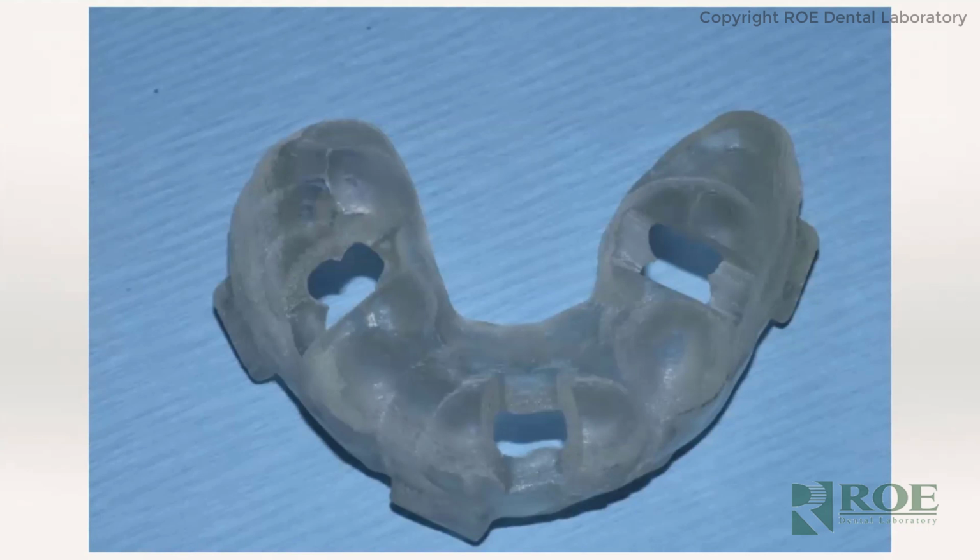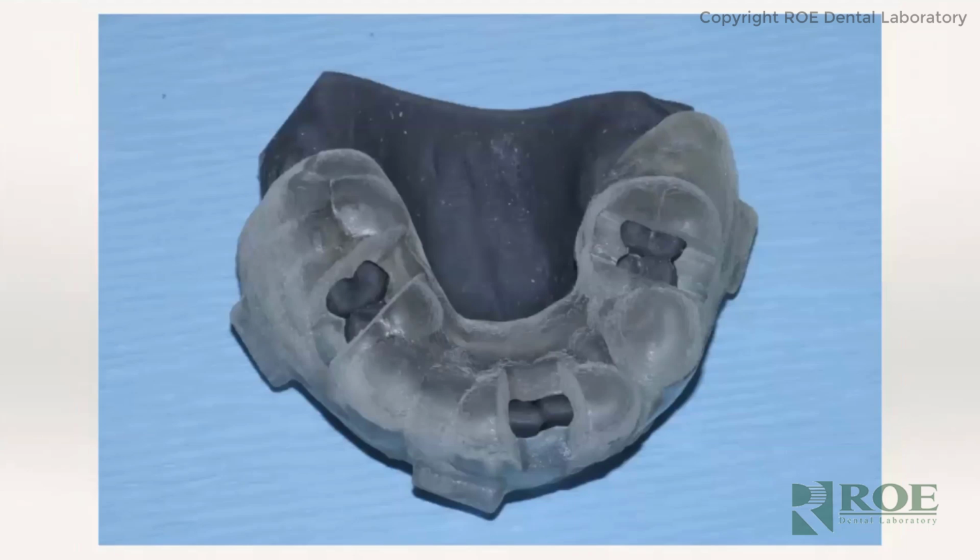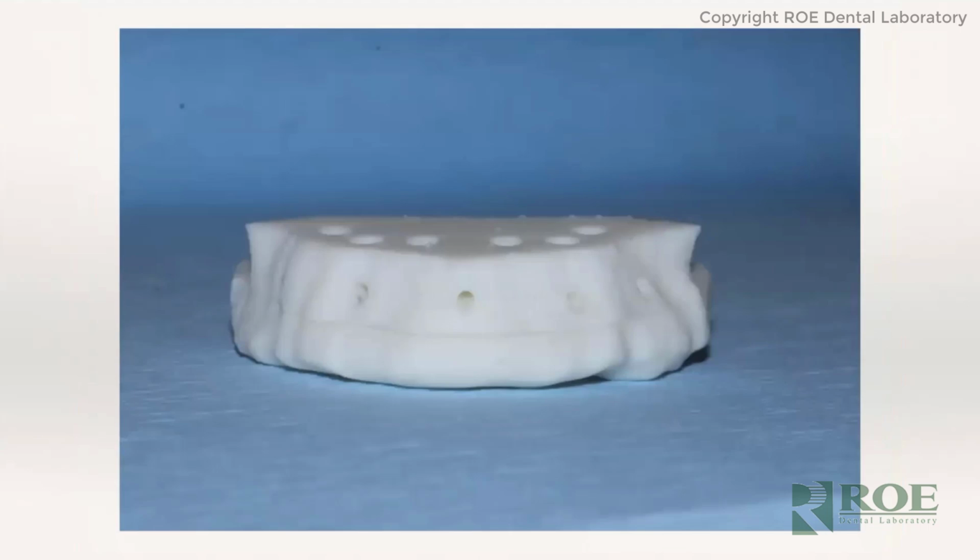So this is what happens when our assistants take these pictures for every single case, they take a look at everything, and one of the things we want to make sure of here, and they know to do this, is to make sure that none of the plastic pieces are broken that go into the bone reduction guides, and the holes are patent. So they'll place this over the top of the model to make sure it fits, to make sure that the windows go down and cover the teeth properly, so that I know how it's supposed to go down over on top of the teeth, and make sure that there's no issues with the fit of this. I know they do this at Roe, but there's nothing wrong with doing a second check.